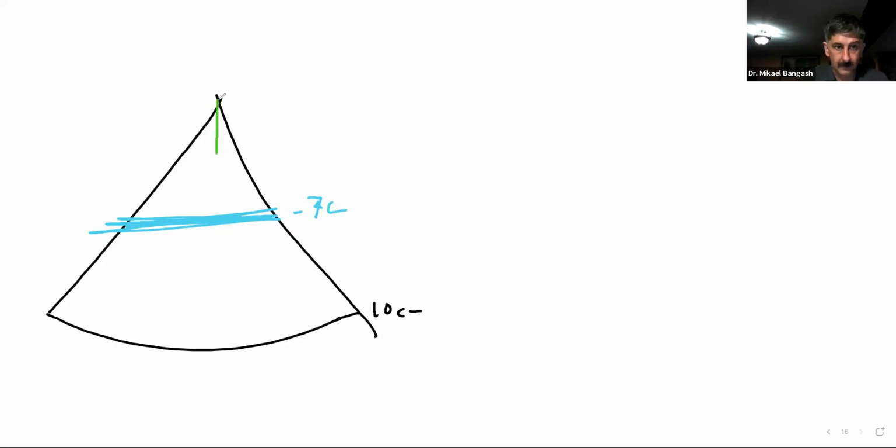And it's a pulsed wave Doppler, this is your sample gate. It's going to be this PRP here, with this single pulse going back and forth. That is going to determine your Doppler shift.